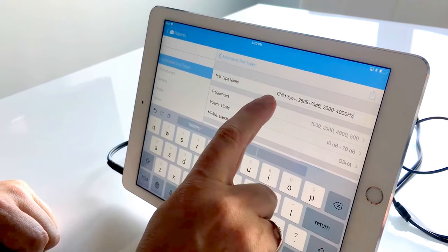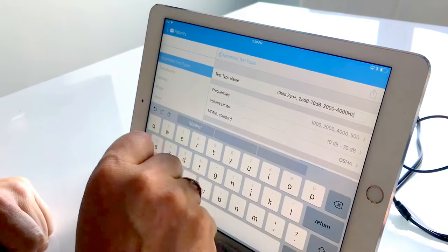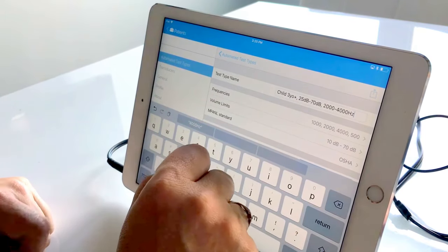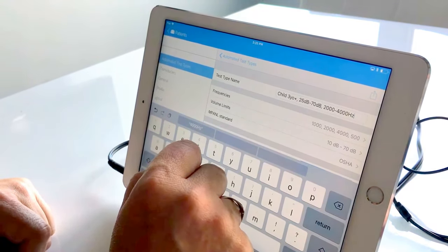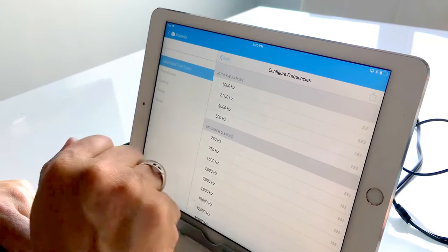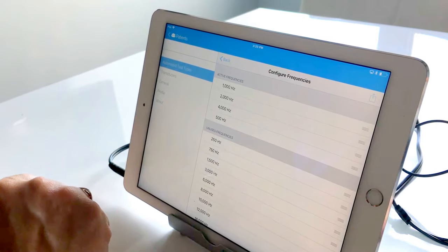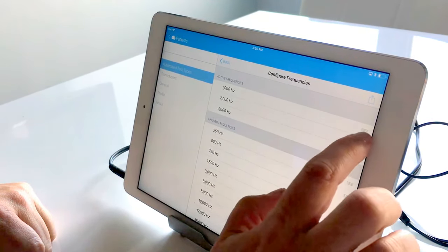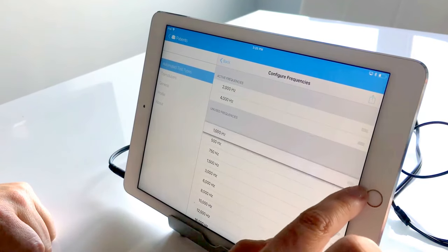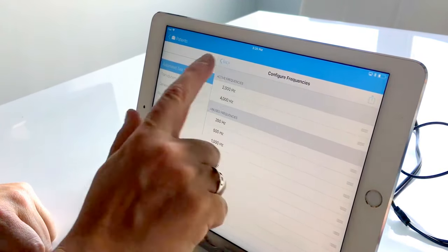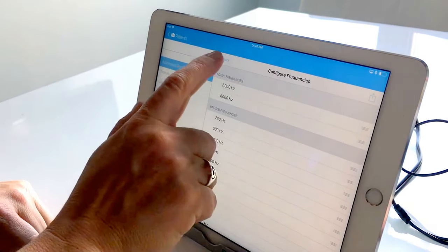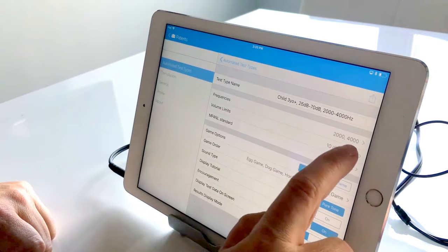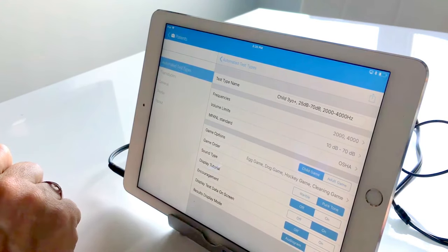So our test type name we see here child three years old plus, our testing range is going to vary between 25 decibels and 70 decibels, and we're going to be testing 2,000 and 4,000 hertz. In order to do that, we will actually open up our frequency configurer and we will remove 500 and we will remove 1,000 as well. So we see here that we have two frequencies listed on our active frequencies.